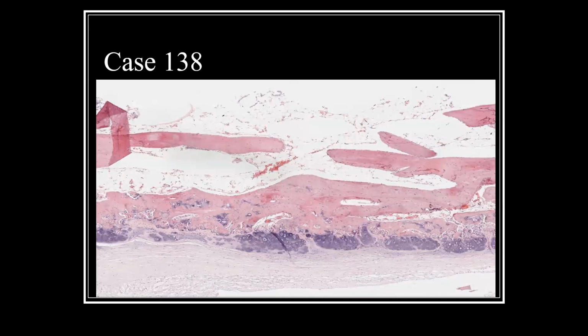Well, this is just a nice histologic example of the way that endochondral ossification occurs here, where you can see this occurring. But this is obviously happening in an abnormal location. This is happening along the subperiosteal surface on a fairly long array of bony trabeculae here. So not in the usual way of an epiphysis, but you're getting endochondral ossification.